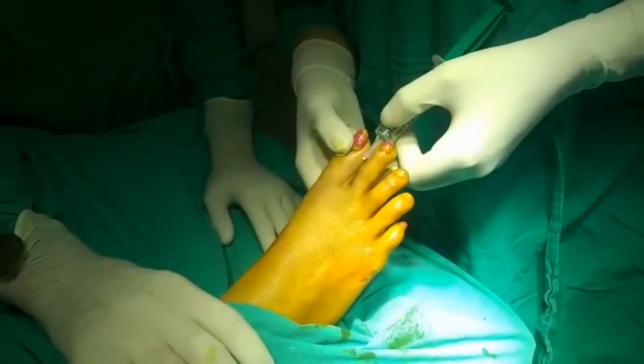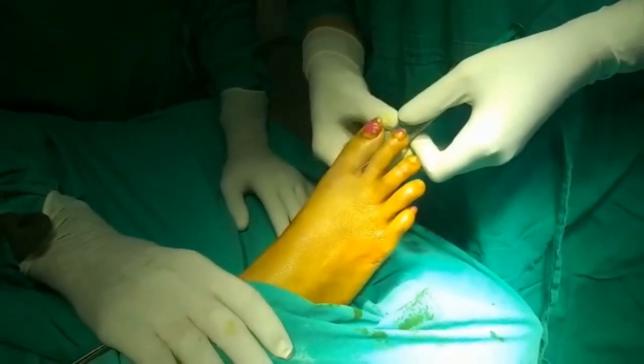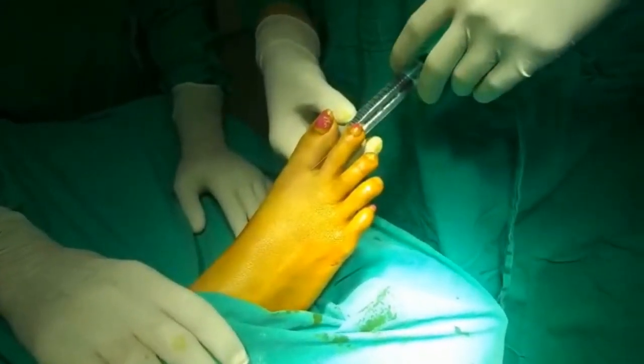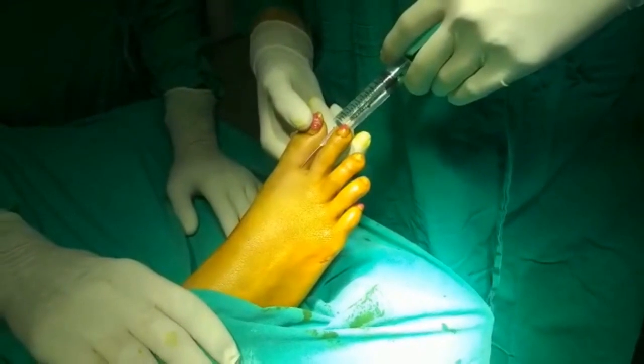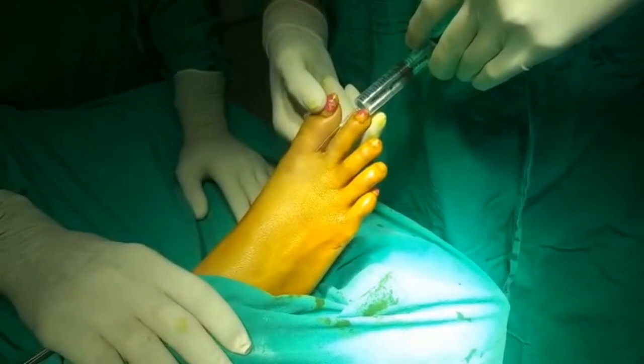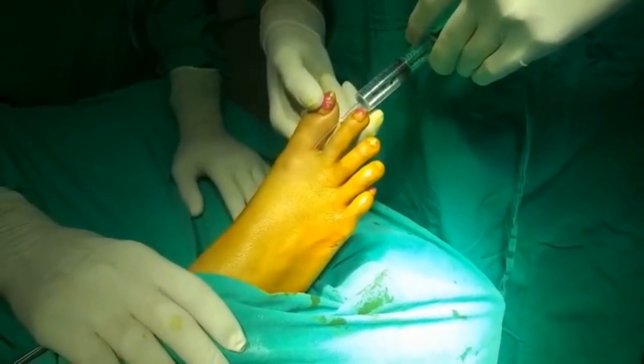Here we can see that we are infiltrating the lateral aspect. Before infiltrating, we always aspirate to see that no blood is entering the syringe. If blood is entering the syringe, you redirect the needle.